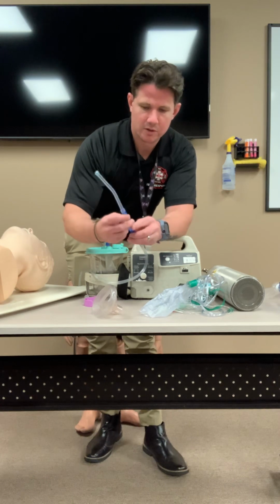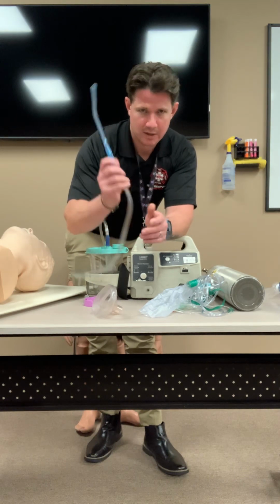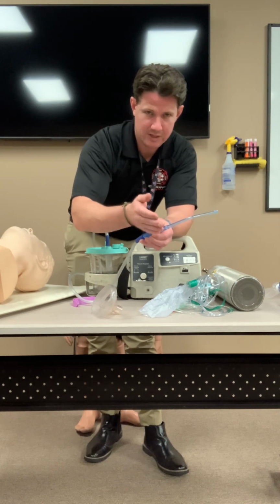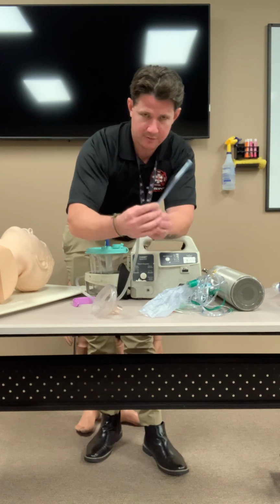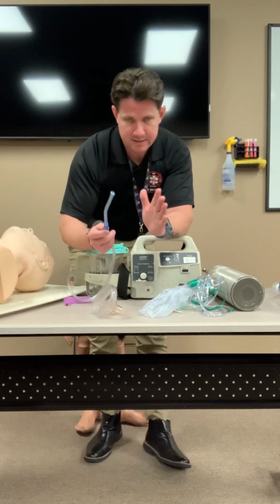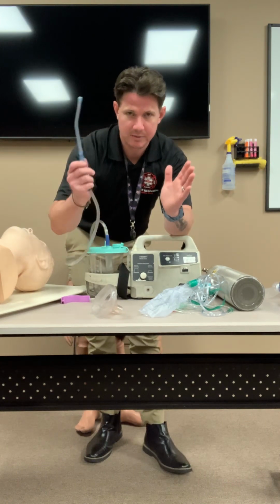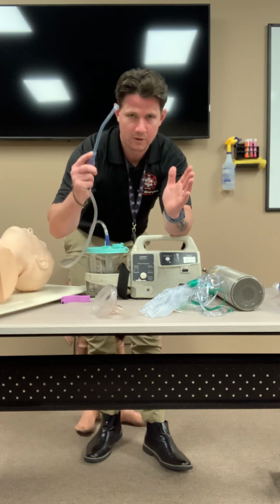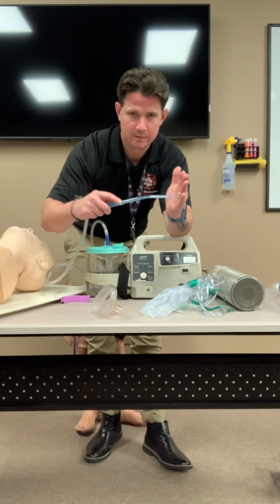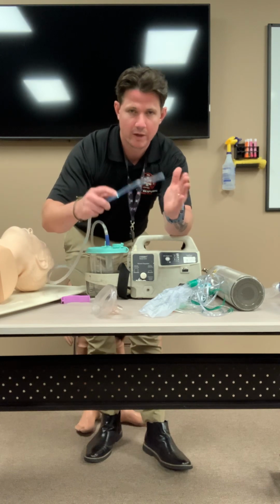If you notice there's a little burp hole right here, this will not suction unless this is covered up, right? It's relieving pressure right now. So I have to cover this up in order for it to create a vacuum. The way that I test this is I take my gloved hand, take my suction catheter, I cover the hole, and you can feel it on your hand. You should feel a little bit of suction, right? Vacuum. Cool, I know it's working.